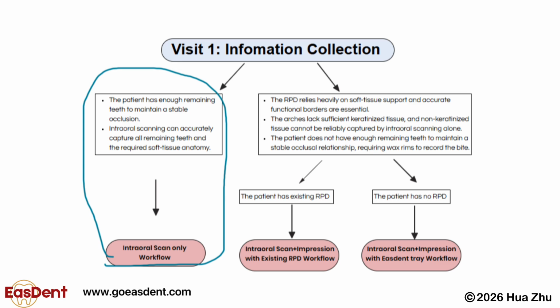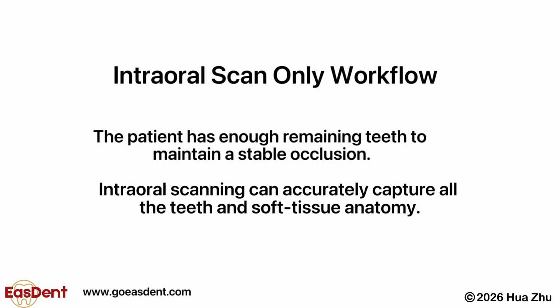The first workflow is the intraoral scan only workflow. This workflow only requires an intraoral scan, with no need for impressions. It is recommended when the patient has enough remaining teeth to maintain a stable occlusion, and the intraoral scan can accurately capture all remaining teeth and required soft tissue anatomy.